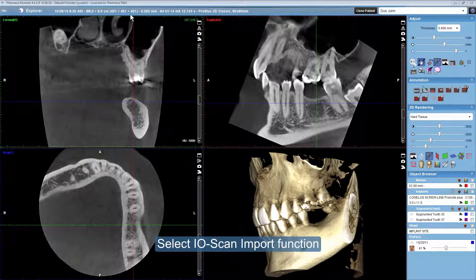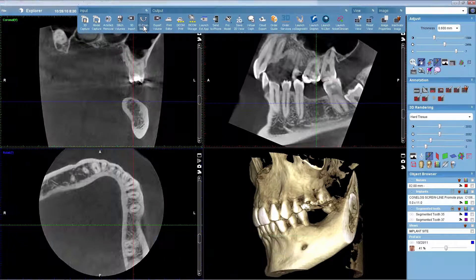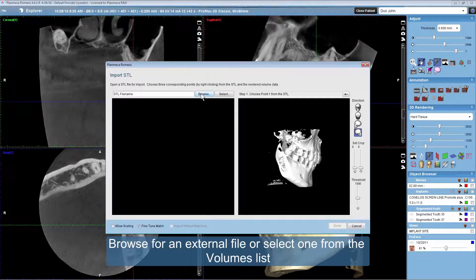Select the IOScan import function. Browse for an external file or select one from the volumes list.